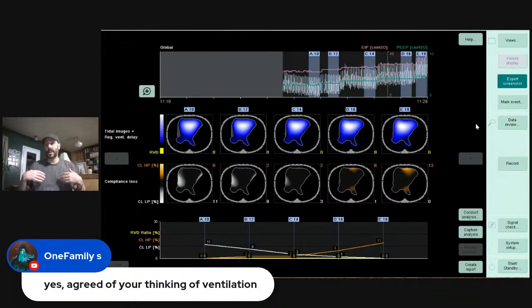I find that it's kind of like a boat driving towards an iceberg, and it can see the top of the iceberg that's over the water. That's us looking at all those numbers on the vent screen. But the boat has no idea what the iceberg looks like under the water. If we don't have electrical impedance tomography, we don't have eyes inside the lung. We can auscultate. X-rays give us a lot of information, but sometimes the X-ray is a lot different from the actual CT scan or the actual impedance tomography.